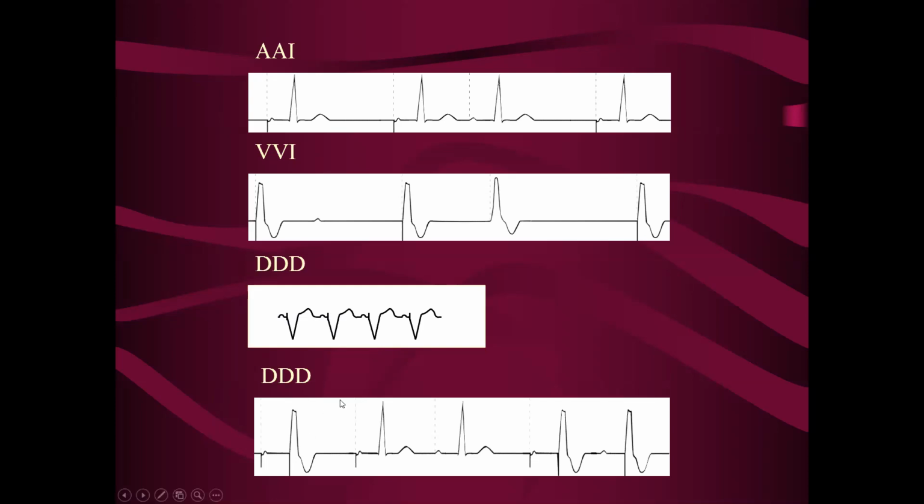Now, on the other side of dual chamber pacing, you can also have it pacing in both atrium and ventricle. That's still dual chamber pacing.